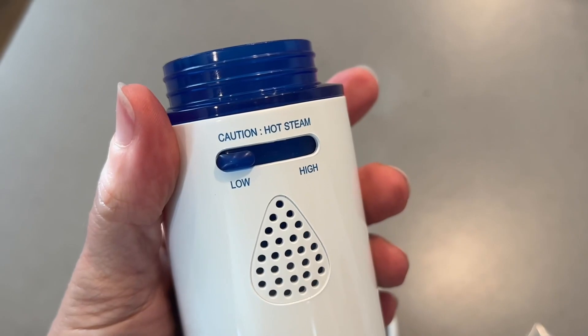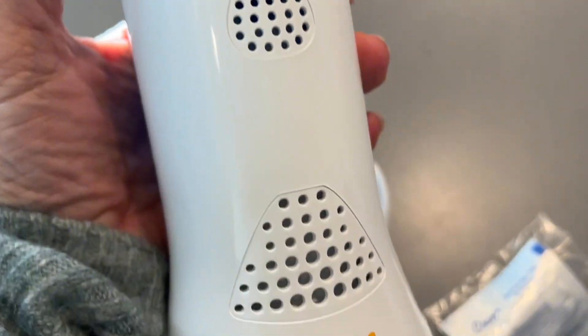The easy-to-hold base has a simple on and off switch that's easy to use, and two steam levels so you can control the amount of steam.